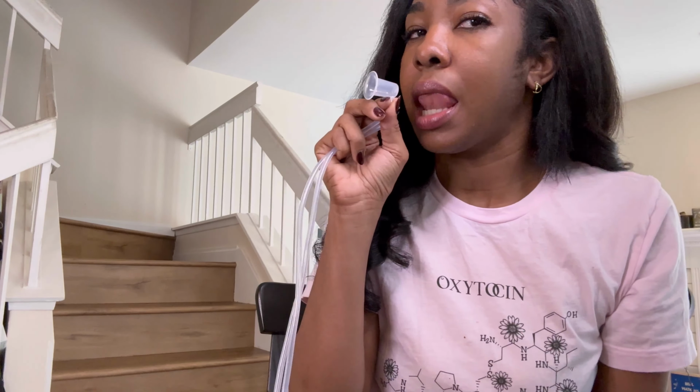Use it as much as you're comfortable. If you want to use it once a day, that should be fine. If you want to use it multiple times a day, that should be fine too. This is not an overnight success tool. This is not something that's going to work instantly to bring out your nipples and keep them out permanently. This is something that you want to use over time with consistency to build up to having a more shapely nipple.